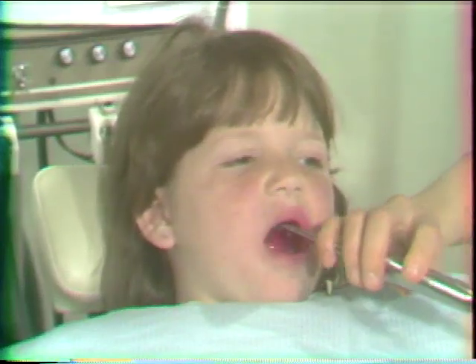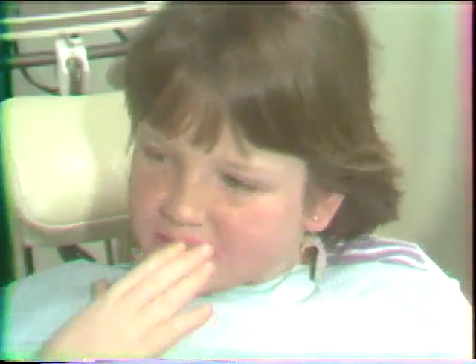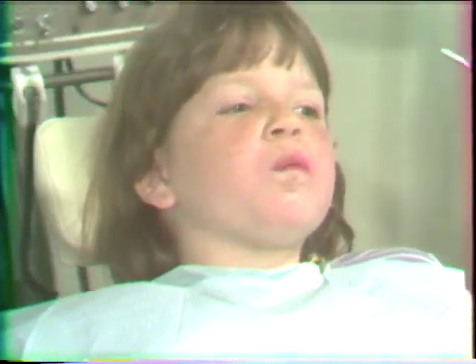Have the patient rinse 1 full minute with the entire APF solution. Immediately have the patient rinse 1 full minute with the 0.4 stannous fluoride solution. The patient should not rinse or eat for 30 minutes following the procedure. Routine dental procedures may be performed immediately.